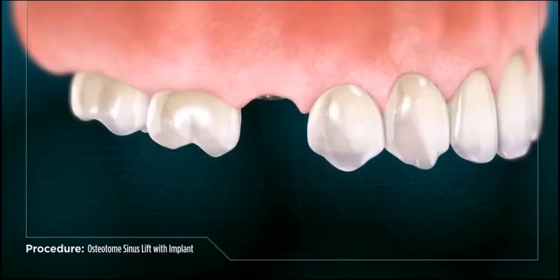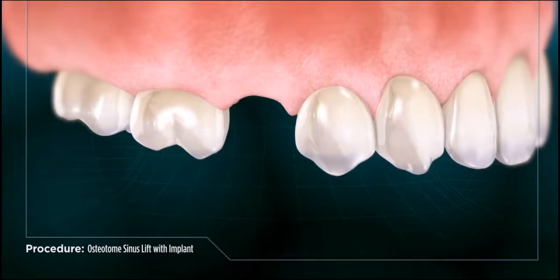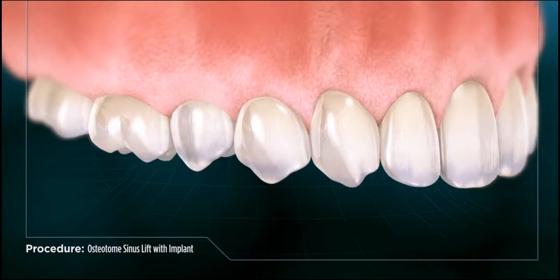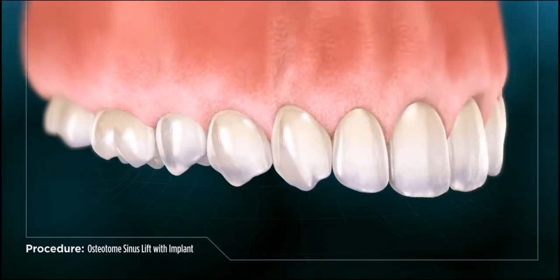After the site has fully healed, the bone will have regained its original strength and stability and the replacement tooth can be loaded onto the implant. With your implant placement complete, your tooth is restored to ideal shape and function.